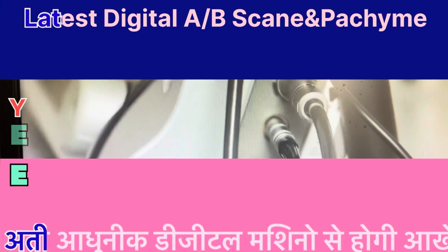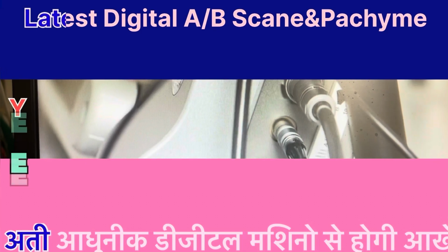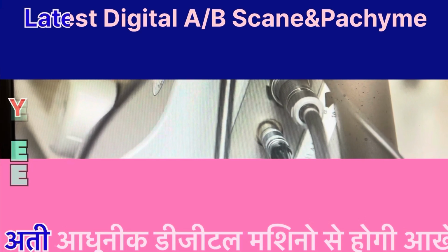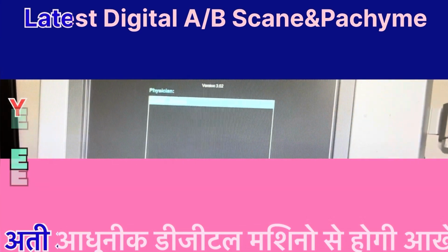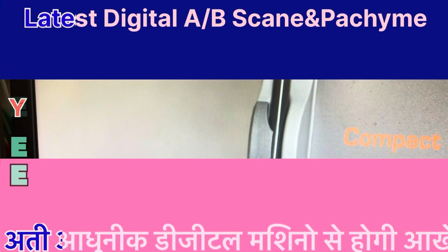On the right side of the unit are a foot switch connector and 3 probe connectors, including one for a 10 MHz B-scan probe, one for an A-scan probe, and a third for a pachymetry probe. Red dots on the B-scan probe and the probe connector guide insertion. The holder for the A and B-scan probes are attached to the right side of the unit. The pachymetry probe holder is located on the lower left side of the device's front surface.